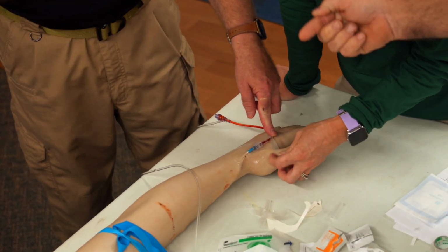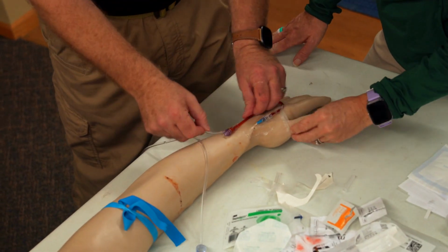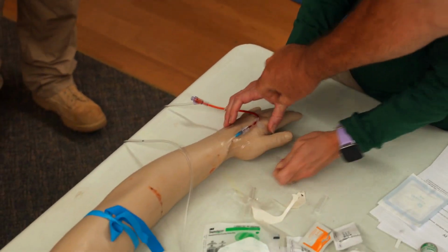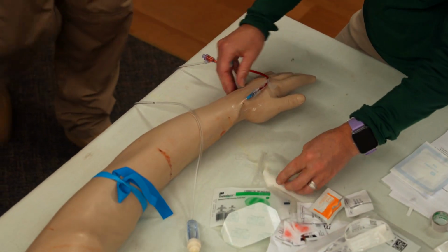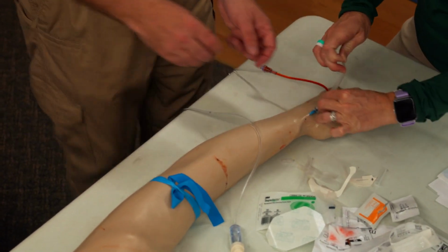You've got tape all the way around, 360 around the whole hole, on that top surface. That's spectacular. And now you add another one up here as a safety, because it's harder to pull that out. That's brilliant. I'm going to start doing that. I watch the paramedics do it all the time. Every time I see them do that, they wrap it around it.